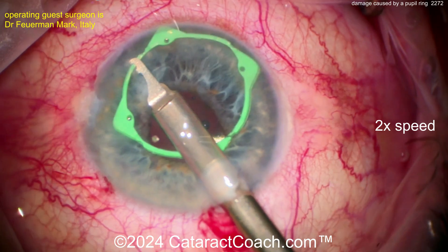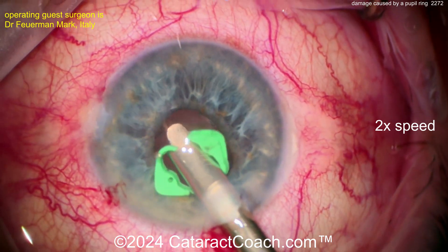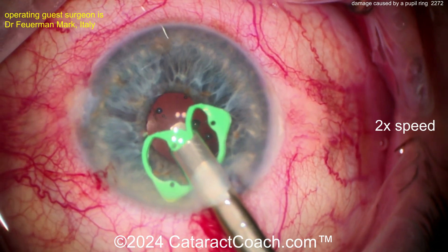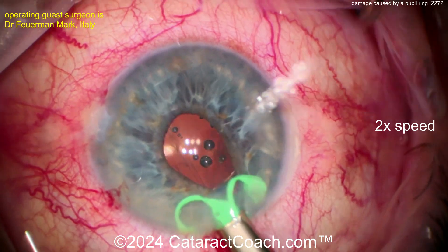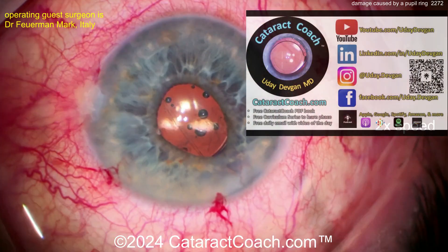But therein lies the catch. This is a little bit of a bulky device, so you grab it there — it goes in, it looks pretty good. Let's pull it in a little more. If you yank it out of the eye like this — now look. What happened? Okay, it looks okay.